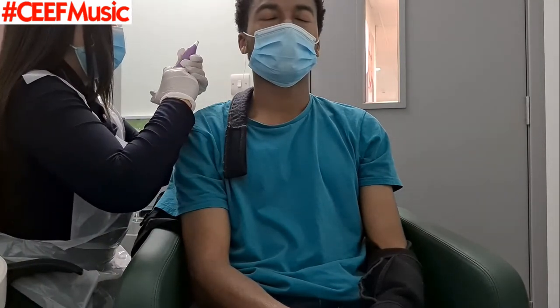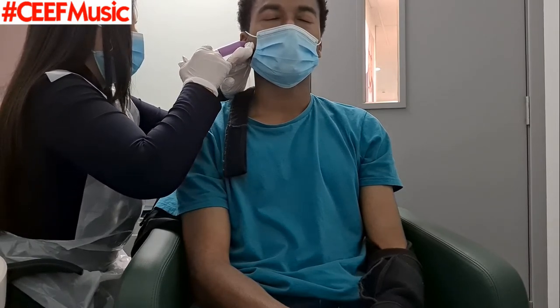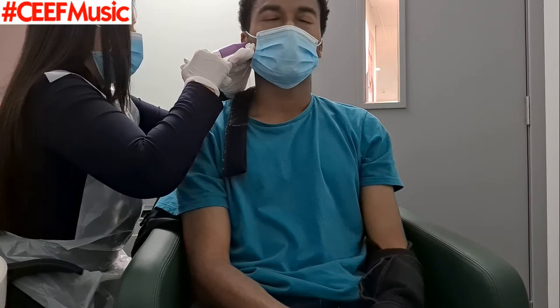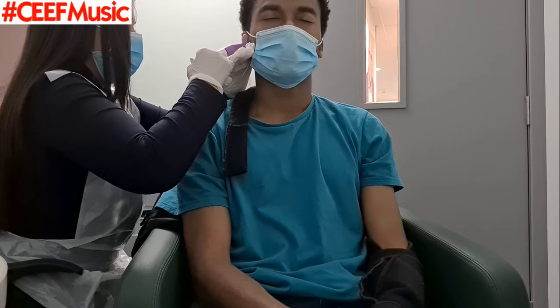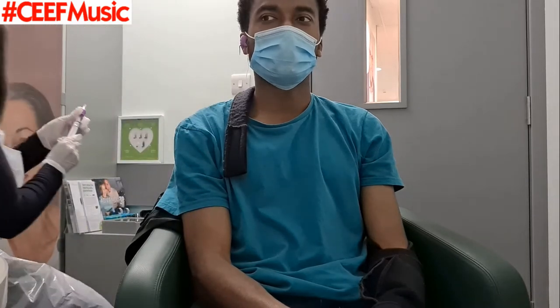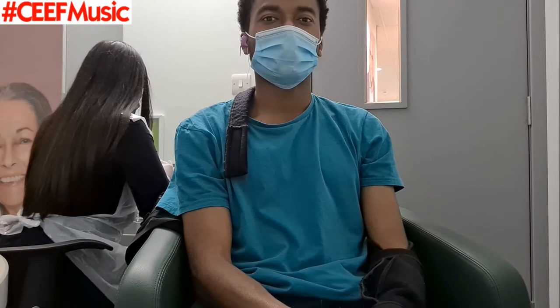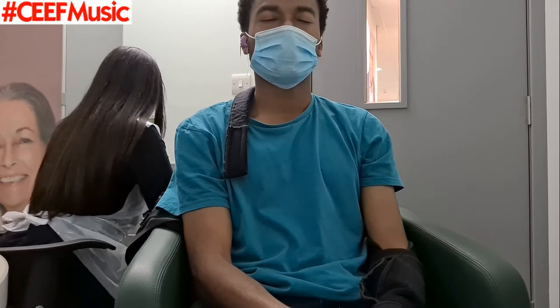Anyone whose favorite color is purple, feel free to let me know in the comments section. My favorite color is red, but purple's still good. Now at this point, this was a really cold material. You see it filling up my ears — literally you just feel it go all the way down the injection. And prior to this, I actually had a professional wax removal literally done about five minutes before this happened. So my ears were super clean.